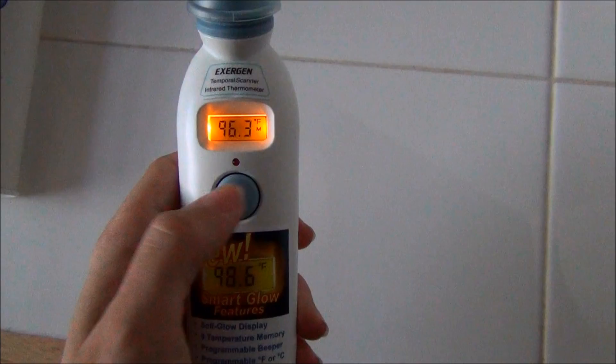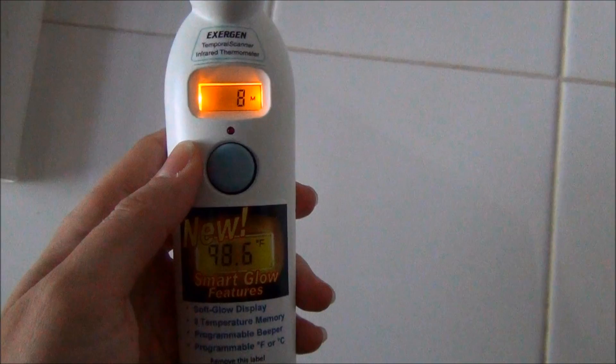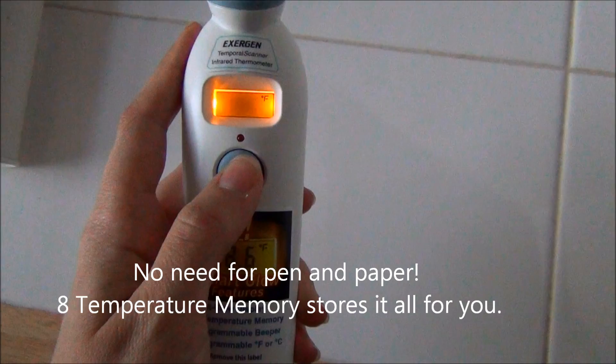So pretty cool, especially if you're trying to see if their fever is going down or going up. It's great to have especially if you need to call the doctor. You can also program it between Fahrenheit and Celsius.